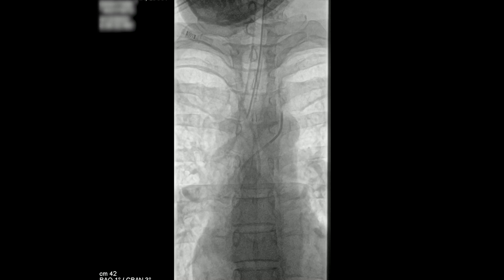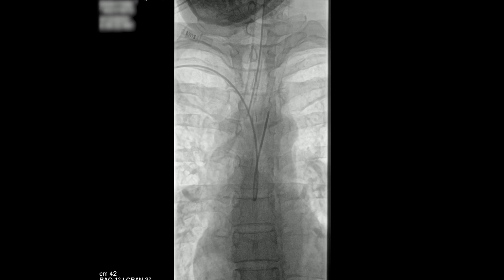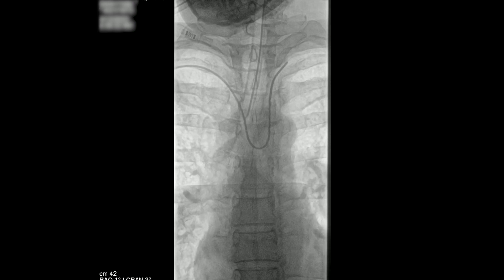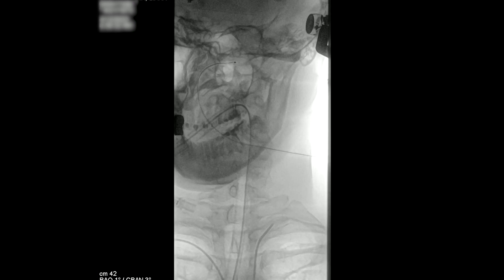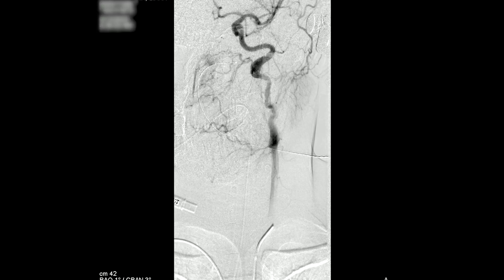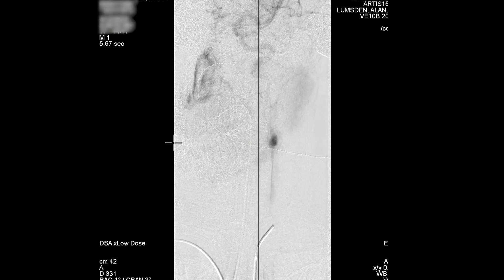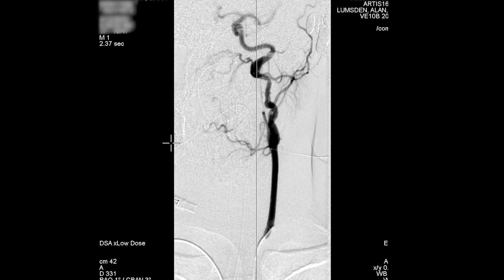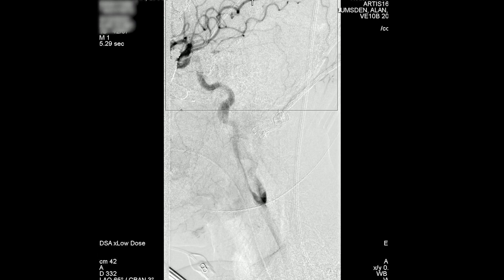Now attention is going to turn to the left carotid. You can see we've pushed it and rotated. Rotating and pulling back, we're looking for this to engage in the left common carotid artery — this really hasn't been edited much, it was very straightforward. So now we're looking at the left carotid. Typically the way I do it is AP neck, AP head, lateral head, lateral neck — it's just easier, moving the gantry backwards and forwards. You can see some fibromuscular dysplasia in the carotid there.